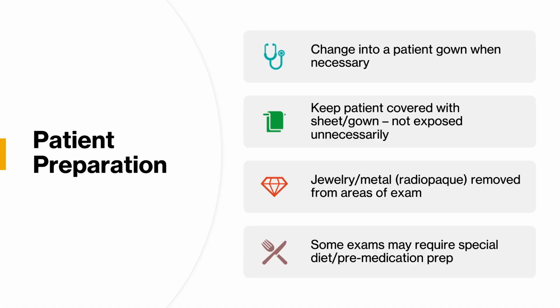Sometimes you'll be taking imaging of the pelvis, and that would be an example of someone that might need to be in a gown, especially if they come in and they have metal zippers or grommets on their pockets, things like that. We've also before seen imaging where people had bedazzled underwear, and so they had to have that removed before they took the imaging because it all shows up on the x-ray.